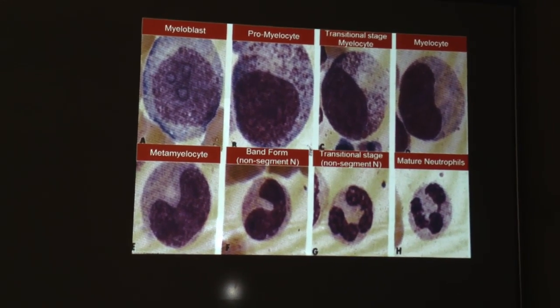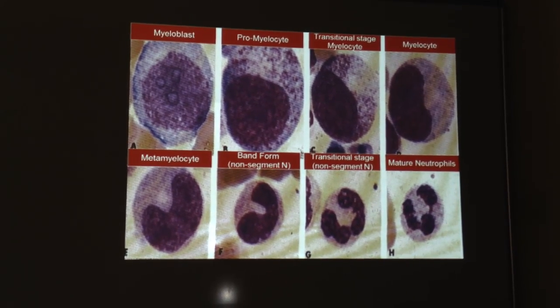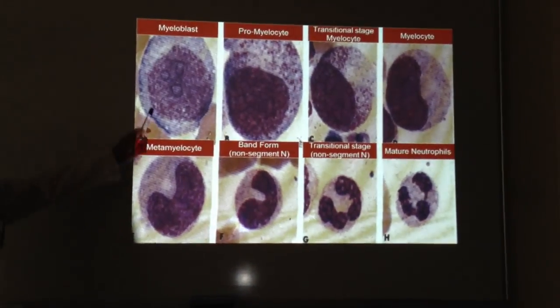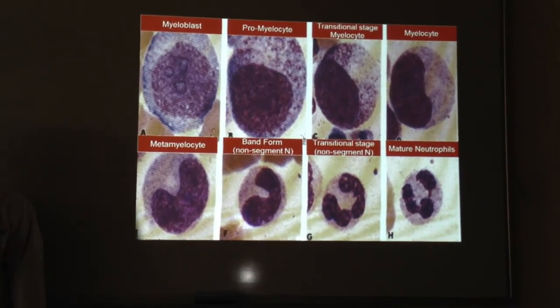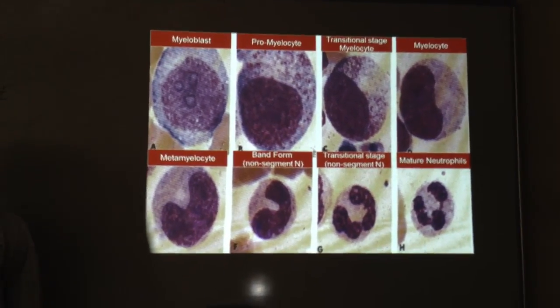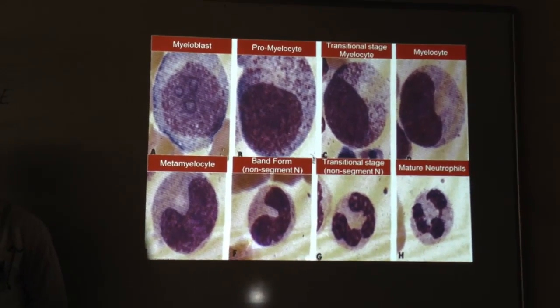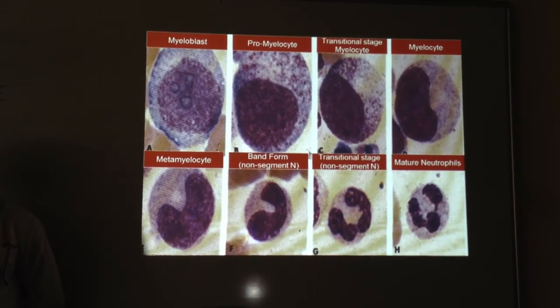One is nucleolus and more than one are nucleoli. Remember this please. Any cell in which the nucleus contains these holes, these are nucleoli. Maybe one nucleolus, maybe more than one. When a cell contains nucleoli in the nucleus, this means it is a very immature cell. Clear? This is a sign of immaturity. Blast cell.